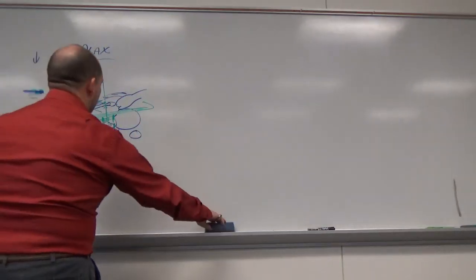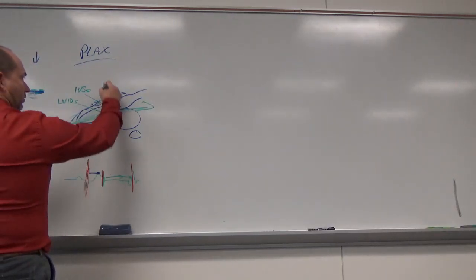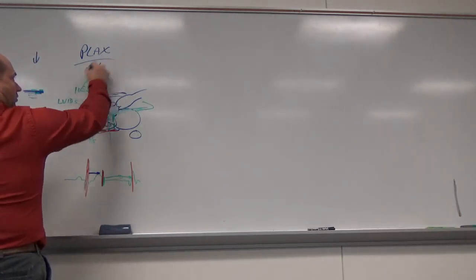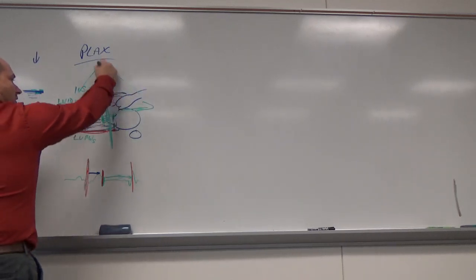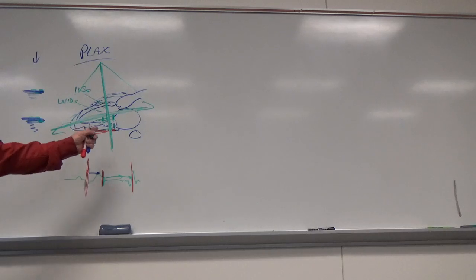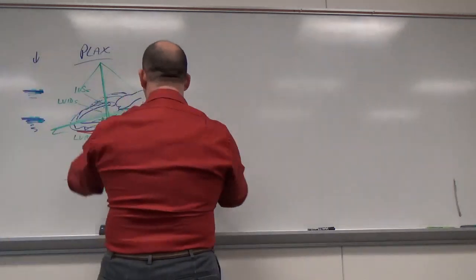Now my image is a total mess. So I'm taking a single line, the same line through that same spot. If I've got my transducer up here, I'm basically taking this line of information and dragging it over time. Only that line of information. So what do I have here?